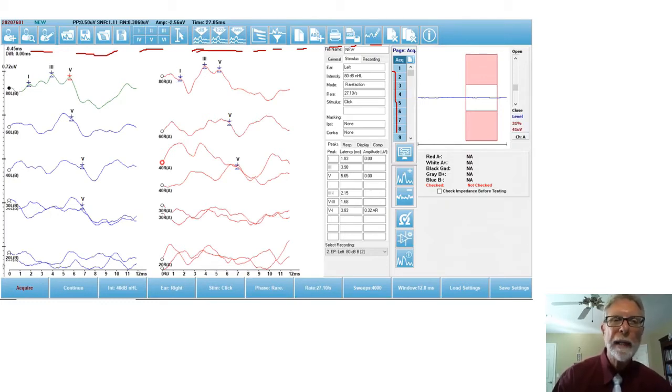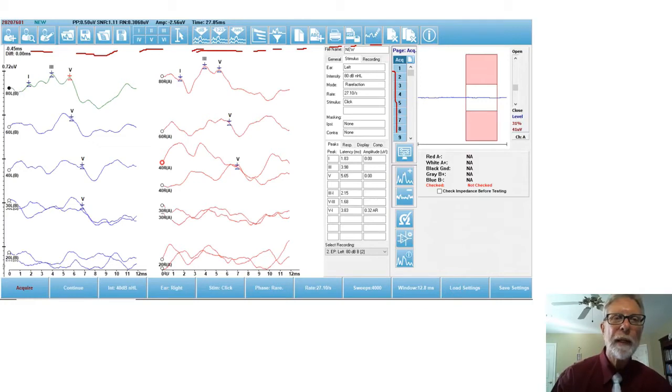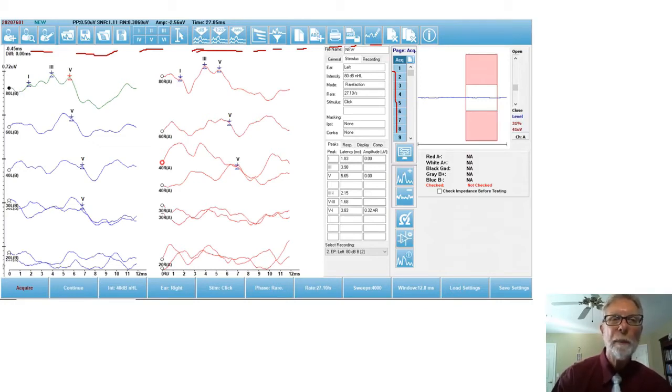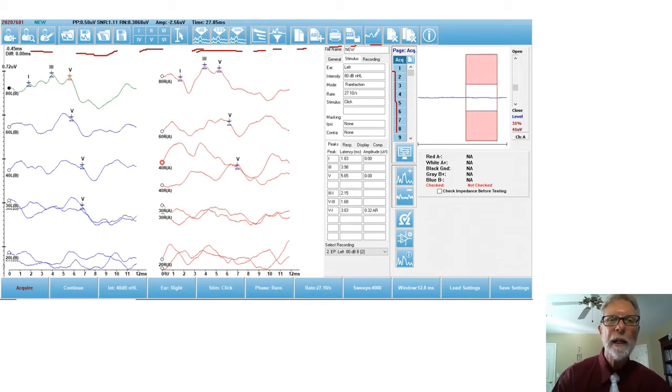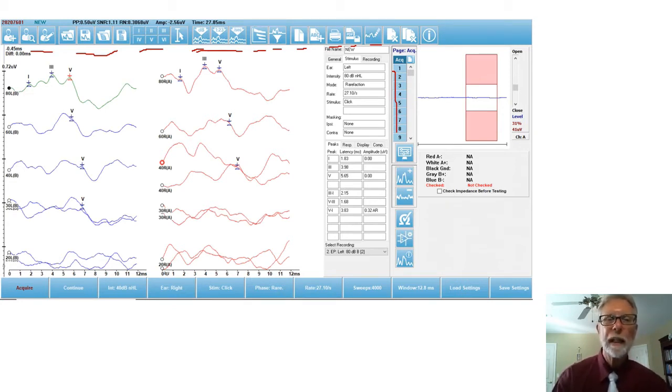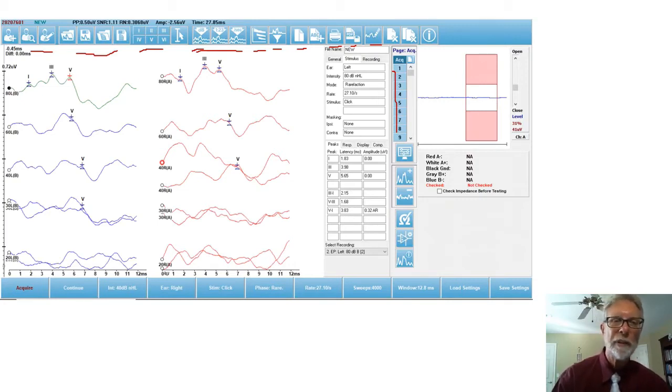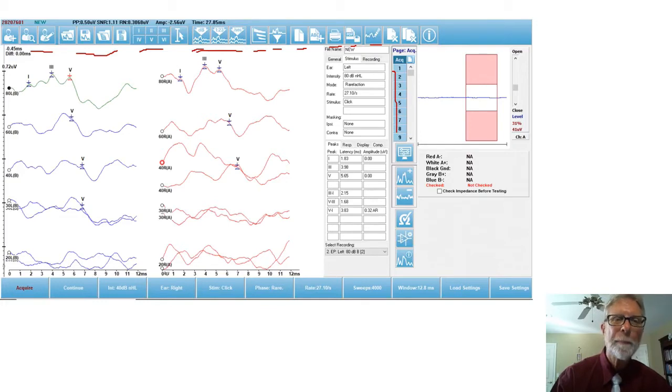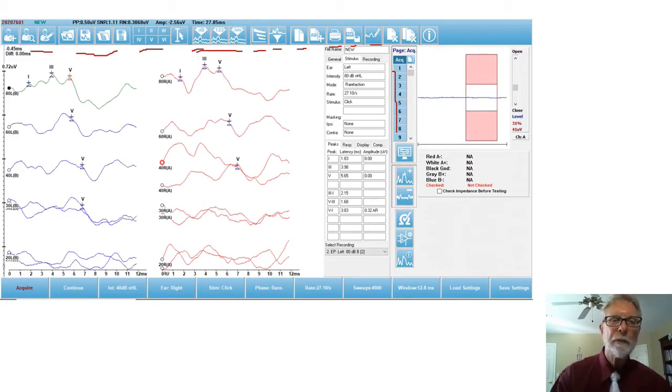I want my ECOGs to be page two, I want my VEMPs to be on page four, and I want my OAEs to be on page five. Whatever I want, that's what I select there, and I can assign them to a particular page. When it prints out, they'll print out the pages in that order and make that type of report.